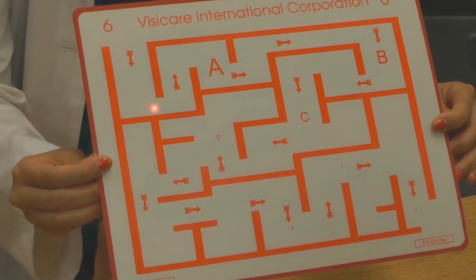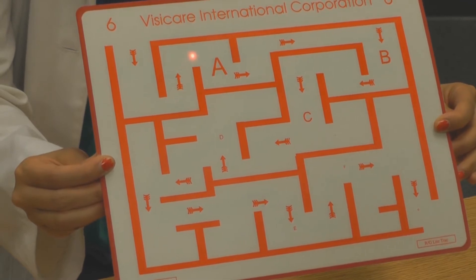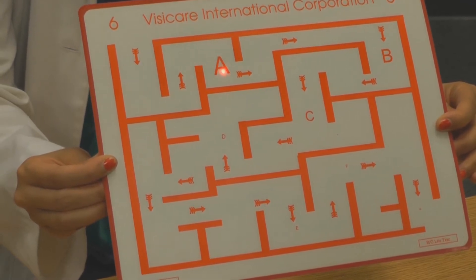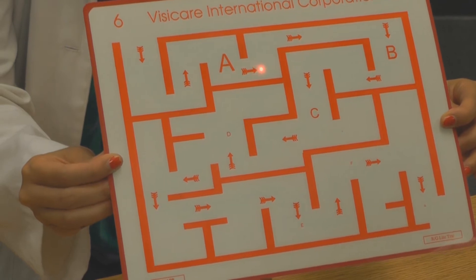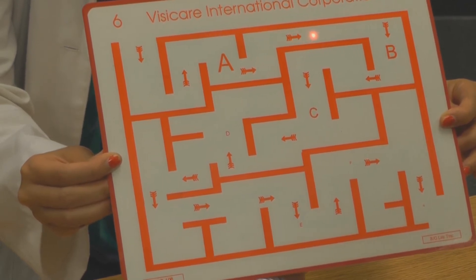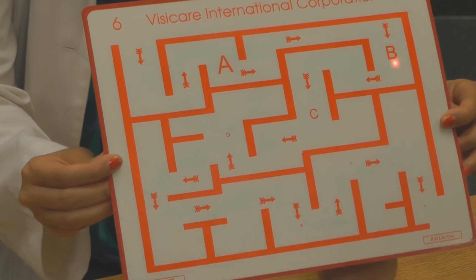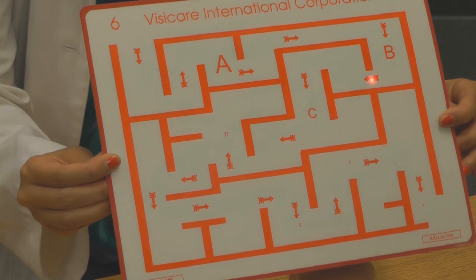This is a direct view of the Brock posture board. The red light is the transilluminator light being held from the underside surface by the patient. The patient is slowly moving the light, traveling through the mazes and hitting the various targets at different times.